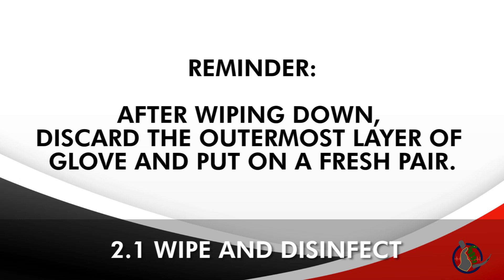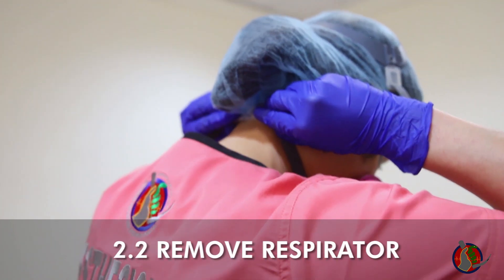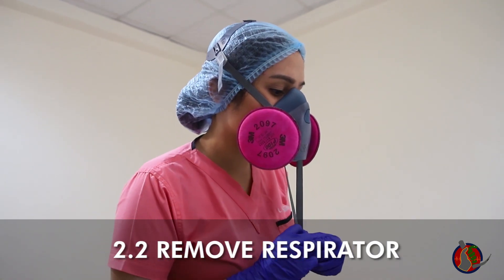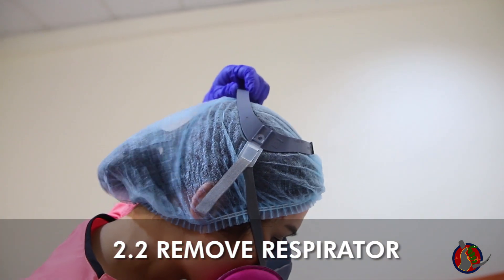After wiping down, discard the outermost layer of gloves and put on a fresh pair of gloves. Leaning over, undo the neck strap lock and hold it with one hand. With your free hand, pull the head strap and let the mask fall forward in a controlled manner.